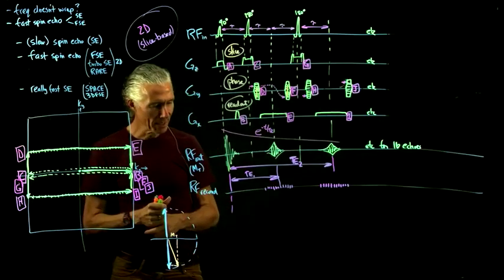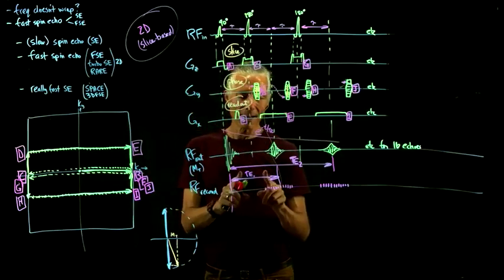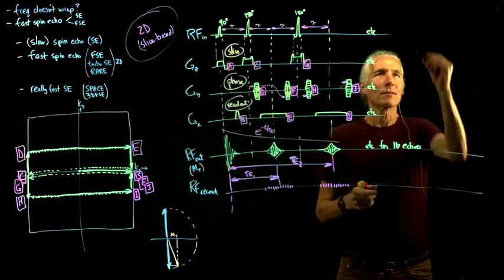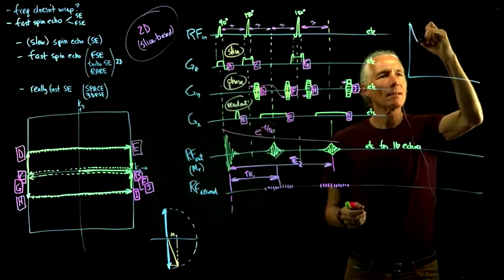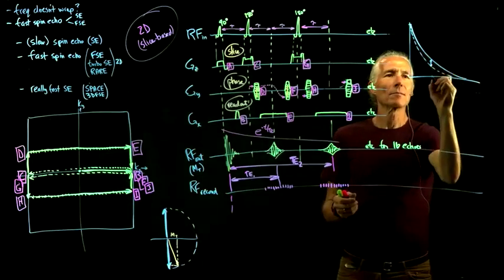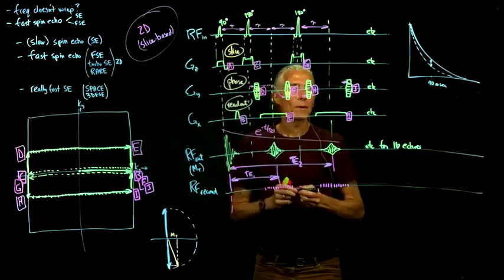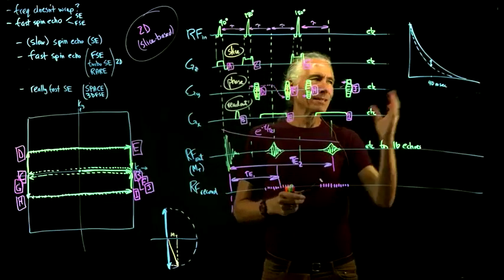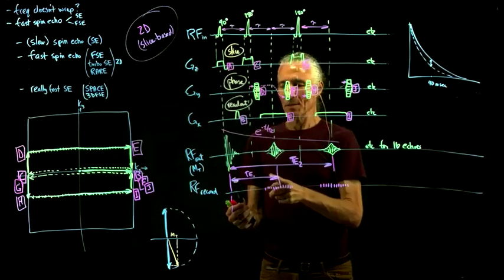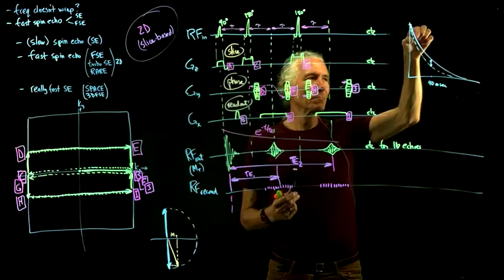So how do you use this sequence? Well, if you want a T2 weighted scan, then you want kind of a longish echo, because you're looking for, I drew it before, but I'll draw it up again. Here's one tissue type and here's another tissue type, like that. So you're wanting kind of a longish echo time, which might be, say, 40 milliseconds, where there's a big difference. But why waste 40 milliseconds when we could just do this first echo very quickly? We could do this one in like 5 milliseconds or 10 milliseconds, very short. And so we'd be wasting all this good signal here.